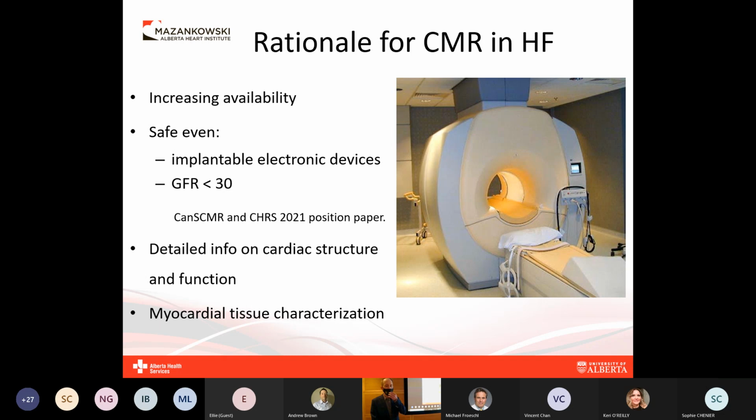Largely we're scanning patients with cardiomyopathy, non-ischemic or ischemic, diseases of the aorta, and congenital heart disease. This is our big referral group. And then we also have a 3T research magnet that's run by our biomedical engineering group, and they do cardiac research as well as brain research.